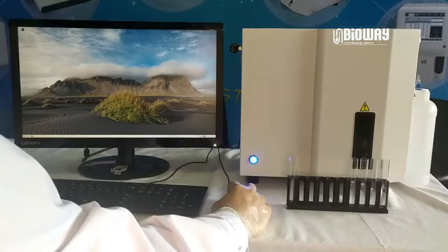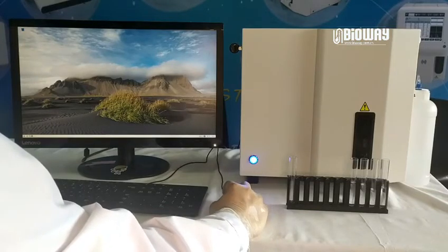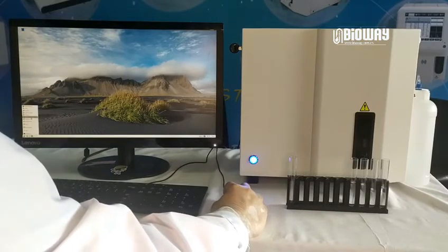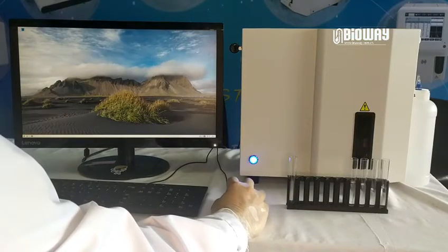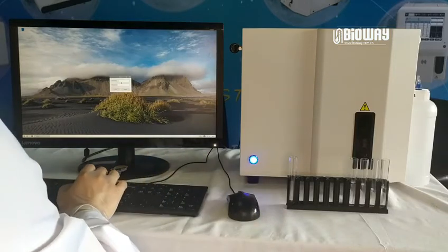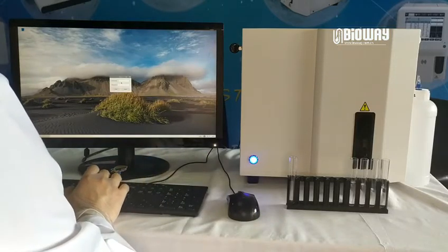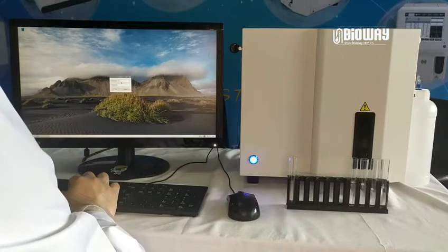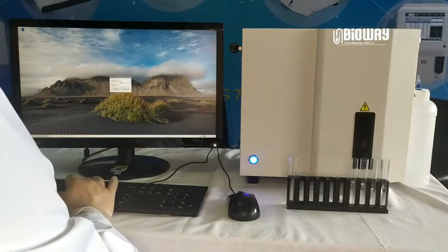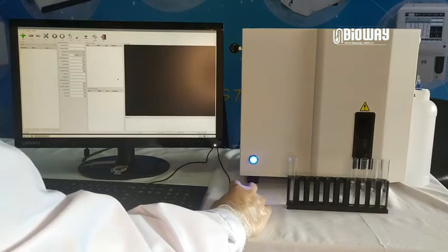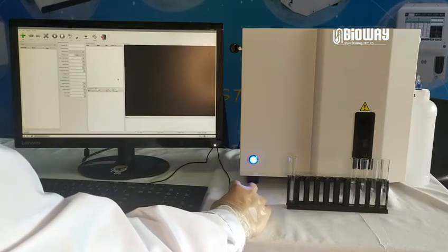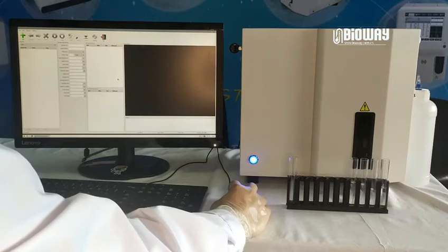Let me introduce how to use the system. First, open the software urine analysis system. I am putting in the username and password. At this moment, the system starts initializing. In this process, operations are not available until it is complete.